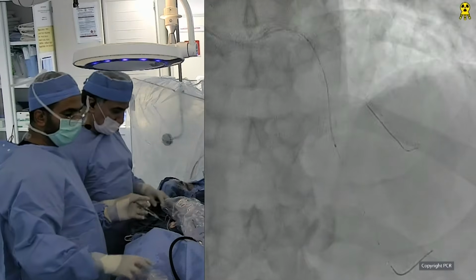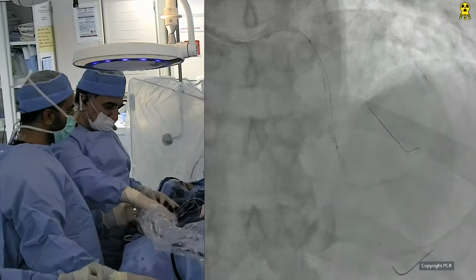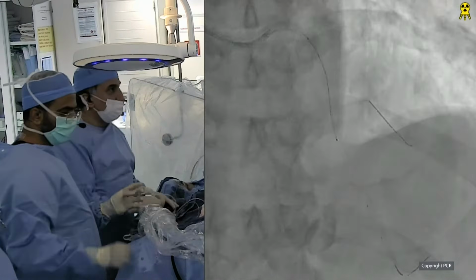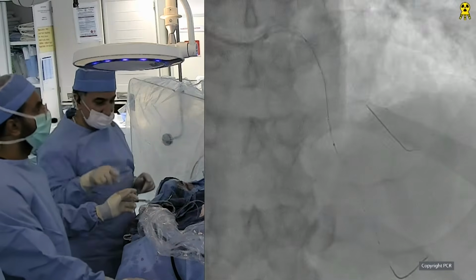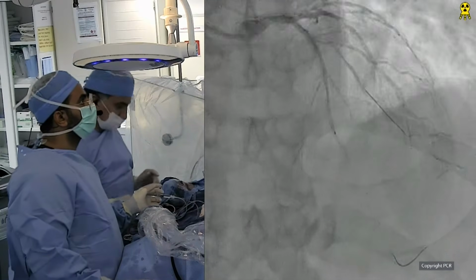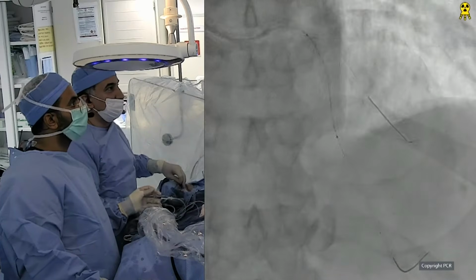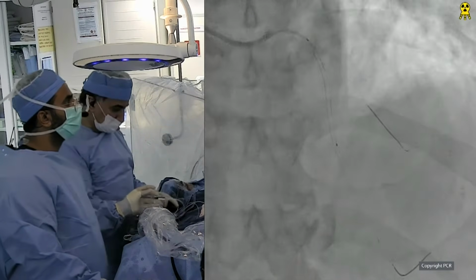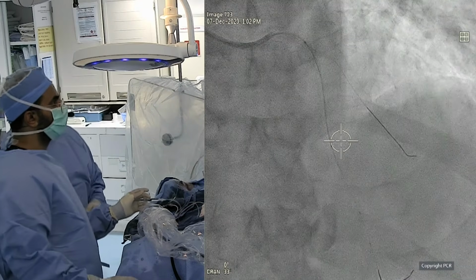If you pull back the catheter a little bit, just a few millimeters. Okay, I think it's perfect as a position. And you tested before with the engagement of the guide the quality of imaging. Very important to have the wire inside because it can orient us. All right, we are ready.